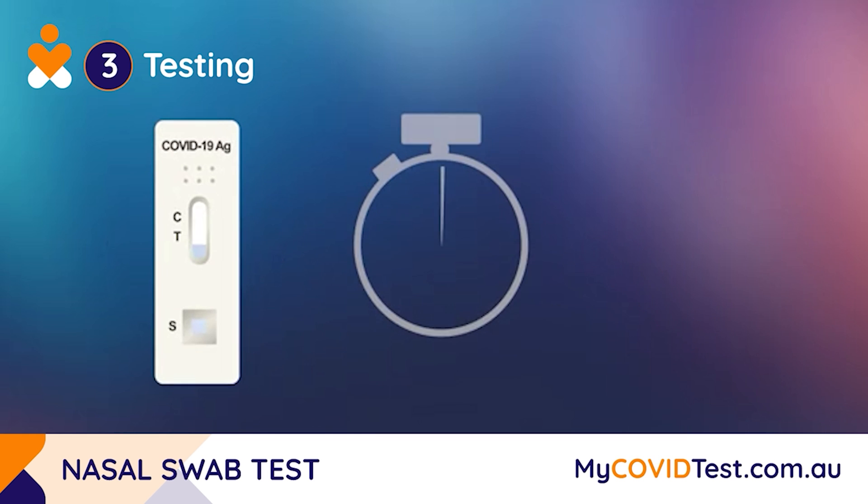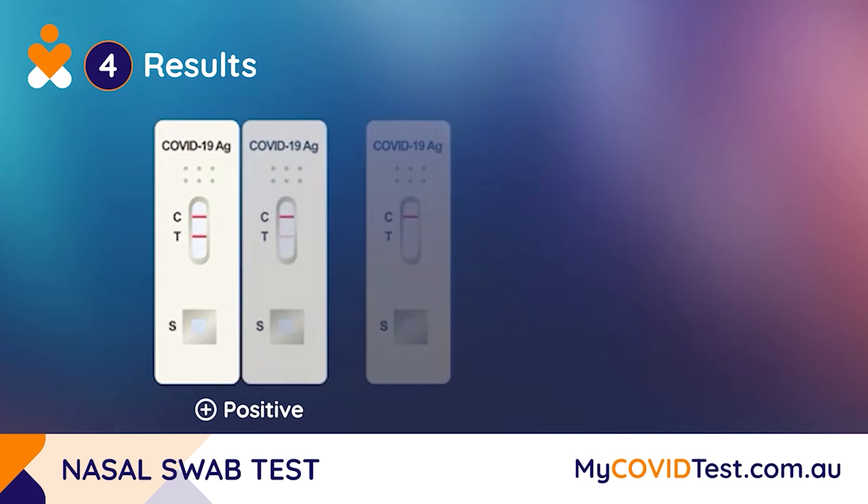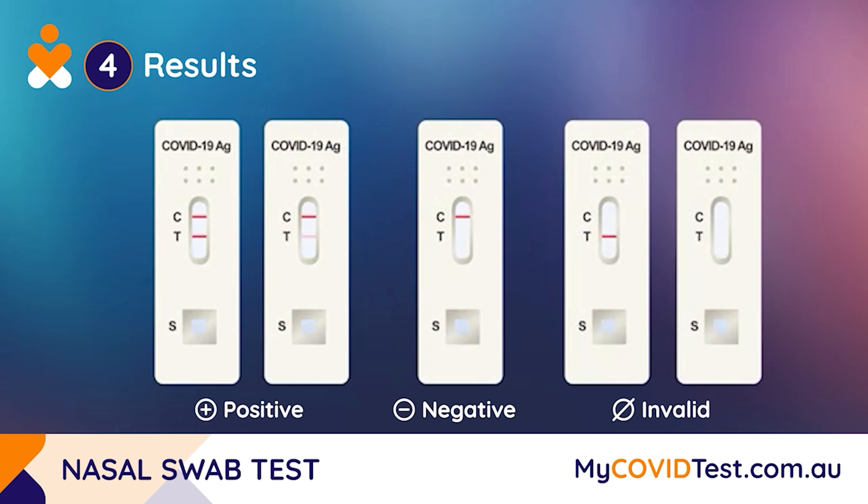Wait 15 minutes to receive your test result. Check the testing device next to the C and T readings to determine whether the test is positive, negative, or invalid.